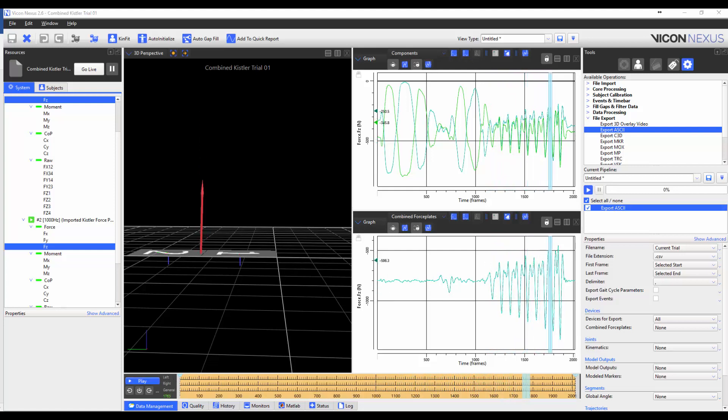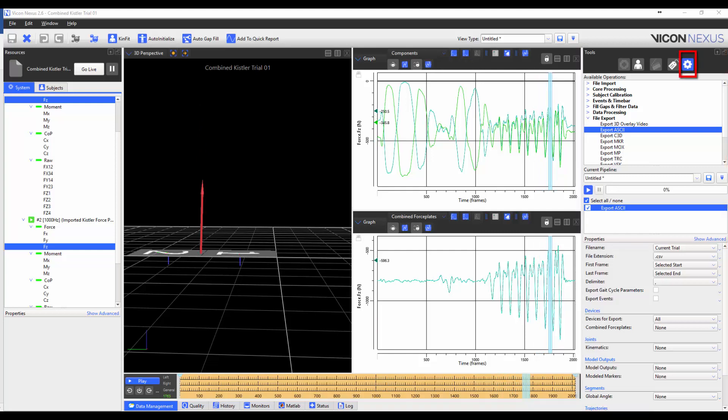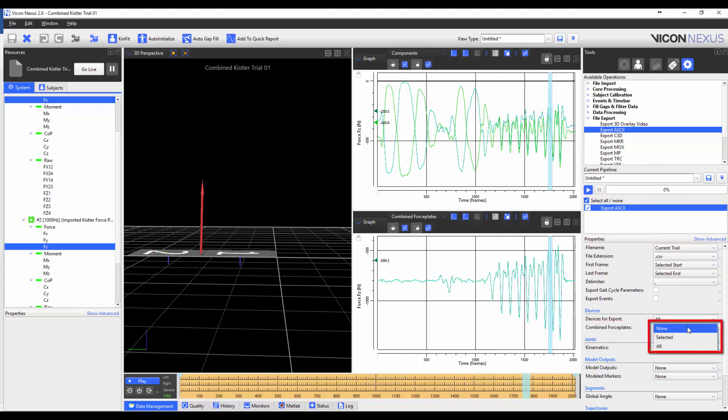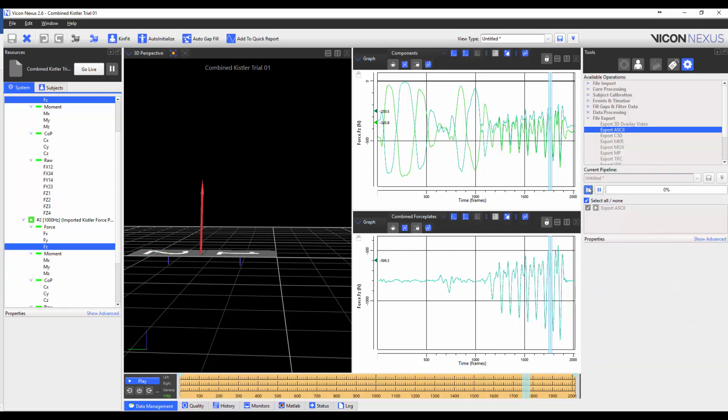You can also export the combined forces into an ASCII file by going to the Tools pane, Pipelines Operation tab. Loading the Export ASCII Pipelines operation into the current pipeline. Highlighting it. And in the Properties, either selecting Selected, or All. And then you can hit play to export it to an ASCII file.